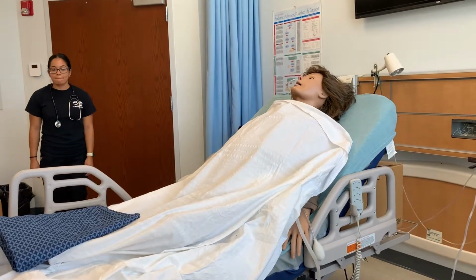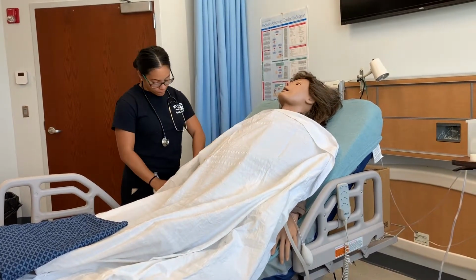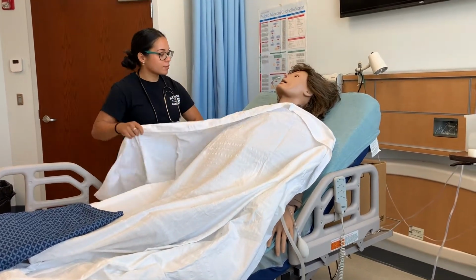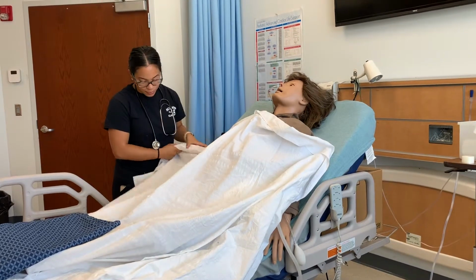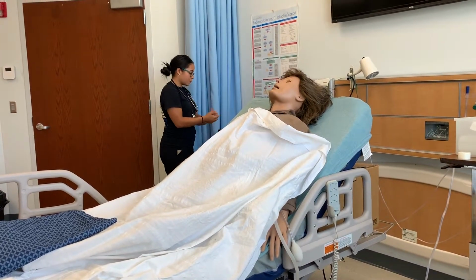Enter the room and introduce yourself to the patient, verifying their identity using the 2 patient identifiers. Perform hand hygiene and observe other appropriate infection control procedures.